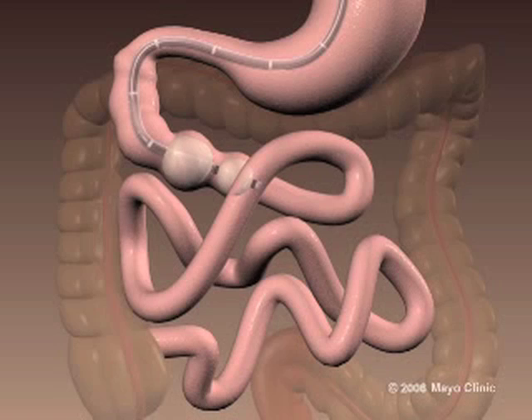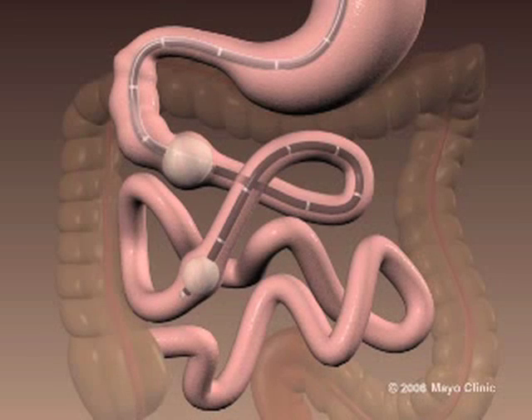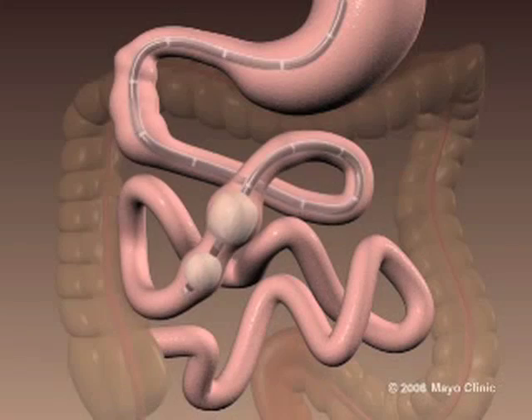This shortens the small bowel and allows further advancement of the instrument deep into the intestine. It is possible to examine the entire small bowel in one antegrade exam, or by combining an antegrade exam with a transrectal retrograde exam in order to achieve complete enteroscopy.